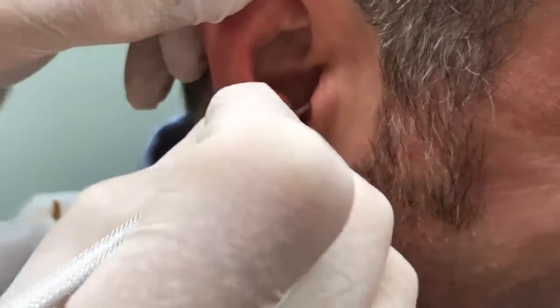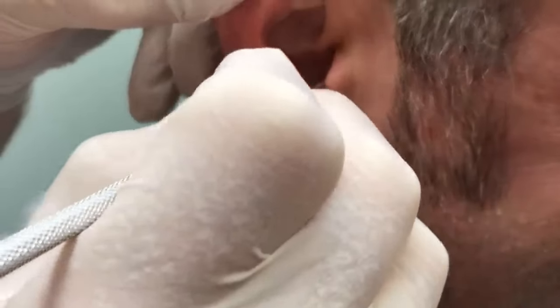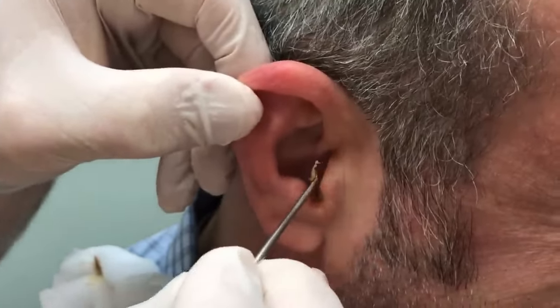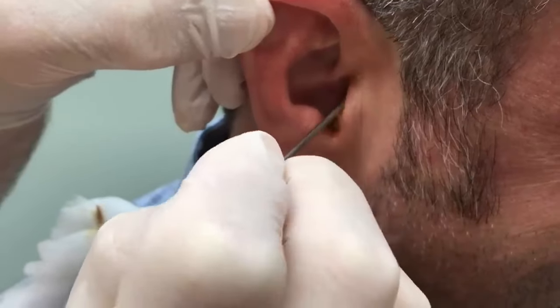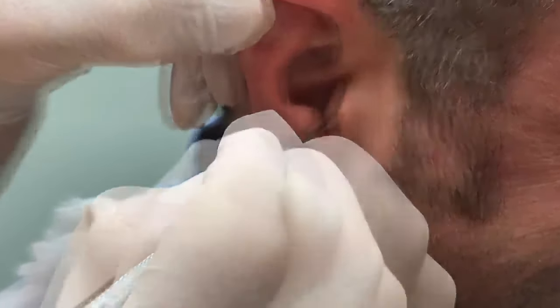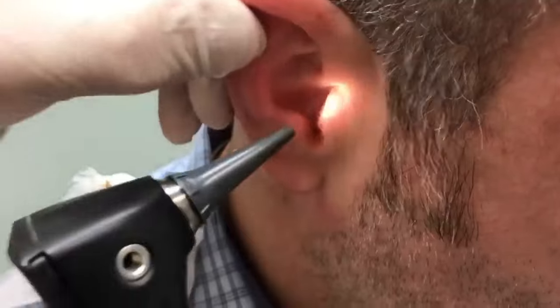Yeah, that's right. There it is right there. Less work for me. I'm just kidding. So what we generally recommend for people that have a problem with cerumen building up in the ears is there are some over-the-counter kits that have a little bit of an ear wax softener product in it. You can use that to soften the wax, and it has a bulb syringe that you can use to rinse the wax out.